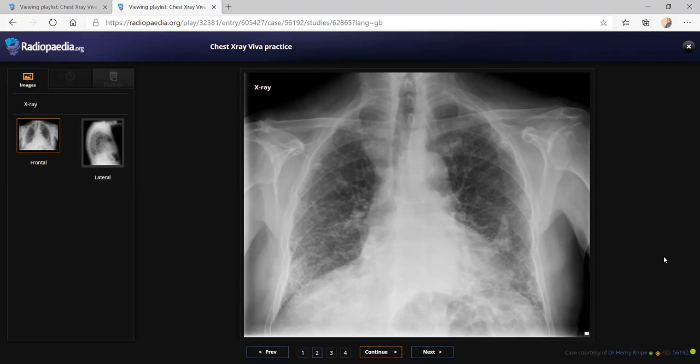So going by the age of the patient and this presentation, I think the possibility of a chronic fibrotic pathology, chronic changes, which may be in the form of fibrosis affecting predominantly lower lobes, as in the case of an interstitial lung disease, or chronic bronchiectatic changes. If there is a history, then I think of the possibility of drug-induced changes or scleroderma.